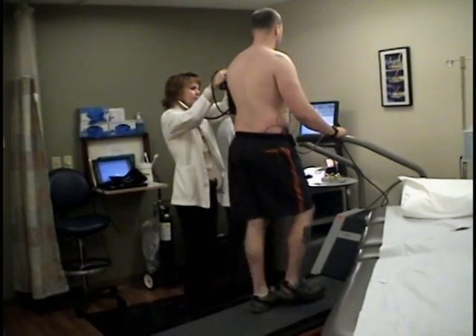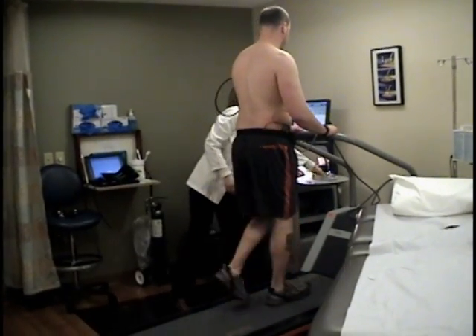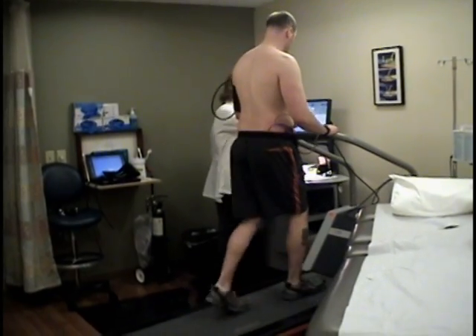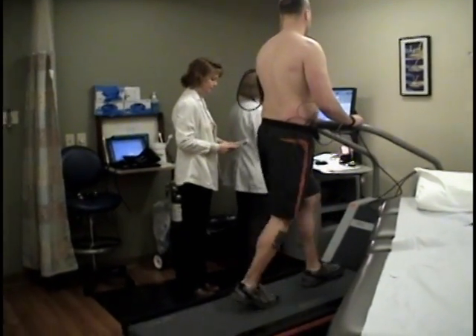If you are an established patient at UCVA, your cardiologist will review your results at your follow-up visit. If you were referred from another physician, the report will be sent electronically within 24 to 48 hours. If we notice an urgent issue, we will speak to a cardiologist before you leave.